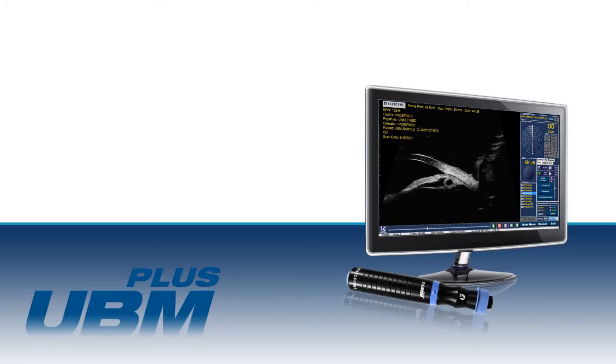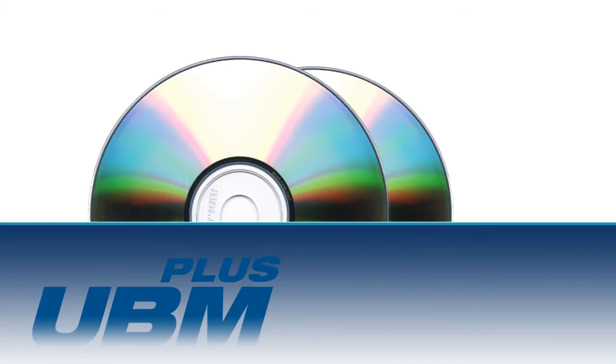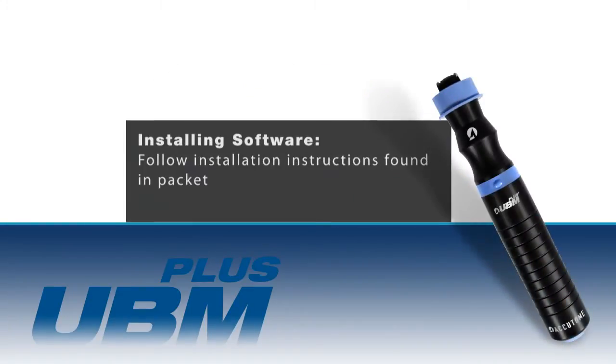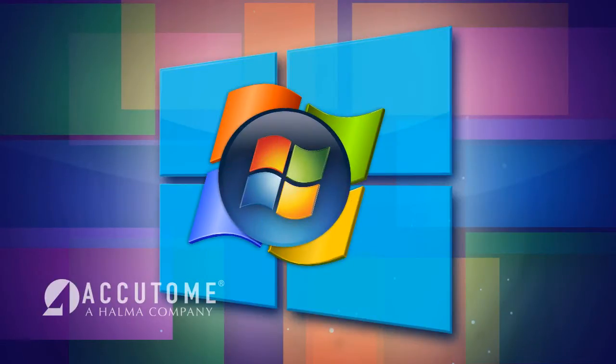The Accutome UBM Plus is a PC-based system that operates off the power of the local PC or laptop. Open the software installation package and follow the instructions provided in the packet. Please be sure you're following the appropriate instructions for your computer specifications.